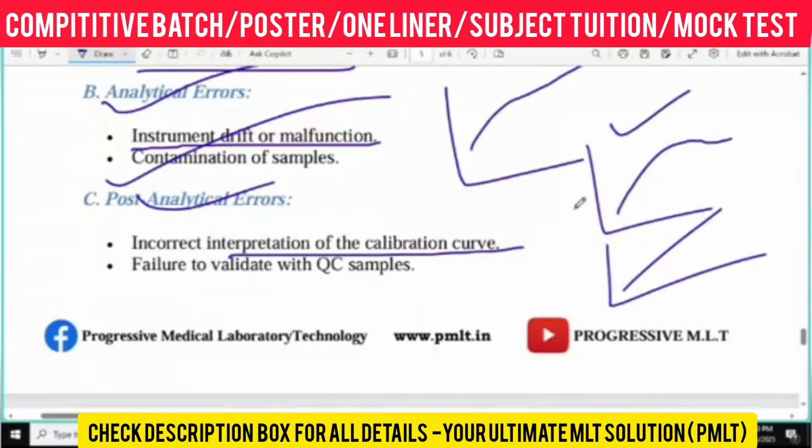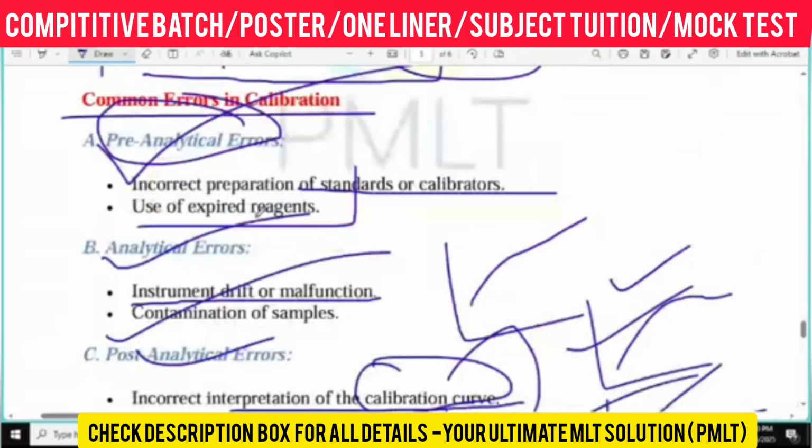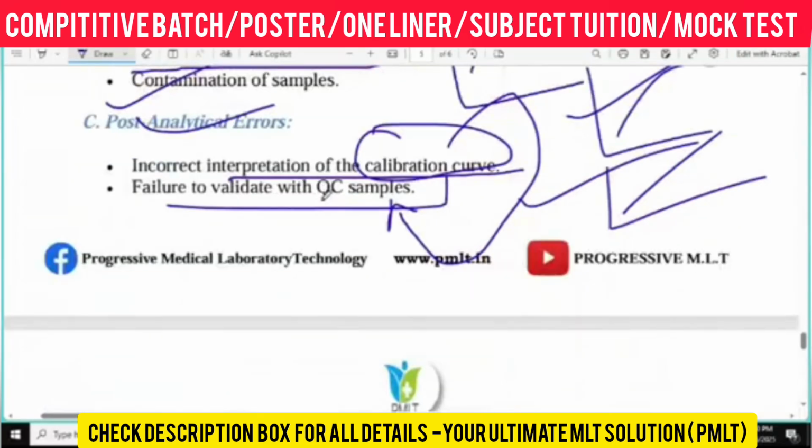Okay, that is non-linear, that is not linear. And failure to validate the QC: if you are not getting the calibration curve properly, you will not match with the QC sample, right? So summing up, pre-analytical means the standard or calibrator is wrong, or the reagent you are using is expired. Analytical means there is some kind of instrumentation fault, and post-analytical means the calibration curve is incorrect, as well as there is no validation of QC.